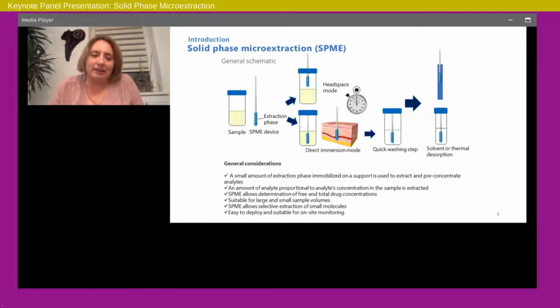So hello everybody. Now I will continue the talk by giving you some more information about clinical applications and some other bio applications like some cell line studies. So basically, whatever Janusz was talking about fits the clinical purpose. As you can see here, SPME, as you already know, is used in headspace mode, also in direct immersion mode, and both apply to clinical or bio applications.